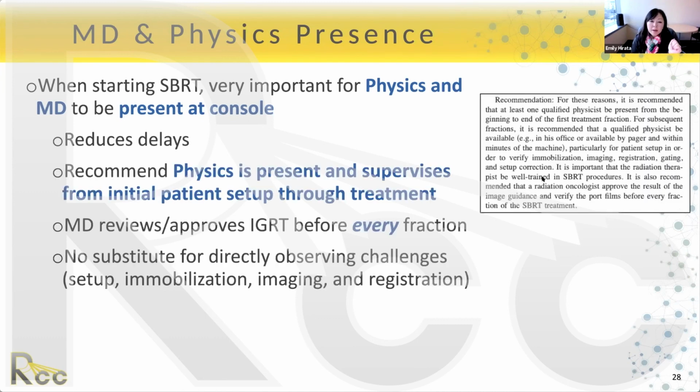The AAPM and the ACR ASTRO guidelines strongly recommend that physics is present and supervises the SBRT treatments from initial patient setup through treatment. So especially when you're starting, essentially what we would do is you'd have the therapist call the physicist to the console as soon as the patient is entering the room, so that physics is able to be there and to supervise and be present for the setup of the patient, the imaging of the patient through registration and all that.